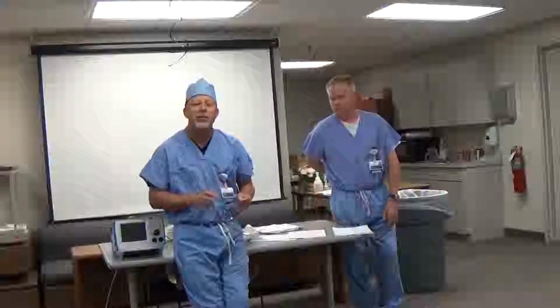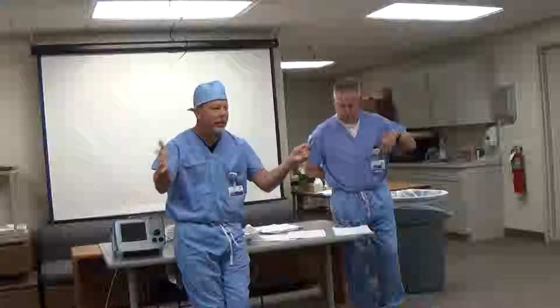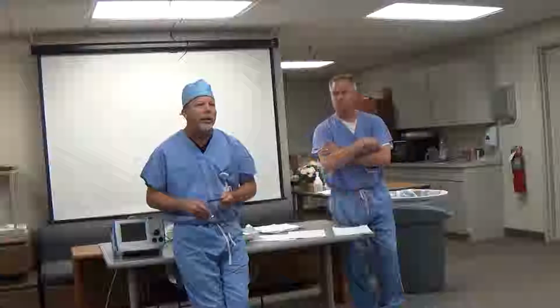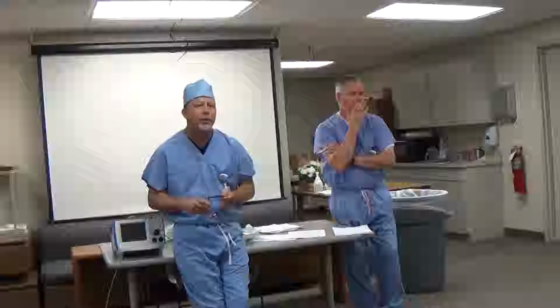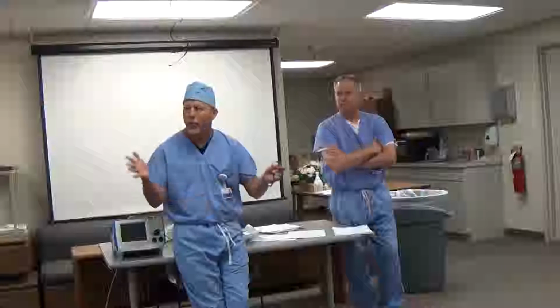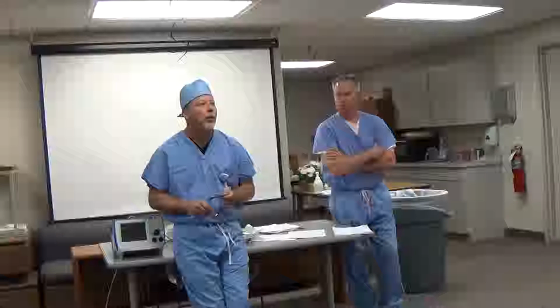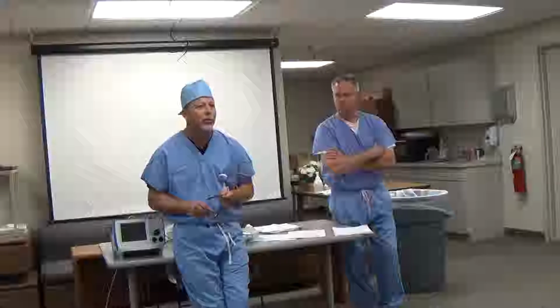We are going to just start right off from the beginning, and we'll kind of incorporate this into everything. But say we walked right into the pre-op area. We were getting ready to go, identify the patient, do our thing before we come back to the operating room. And you walk in the room and their eyes are closed and they're slumped down in the chair. What do you do?